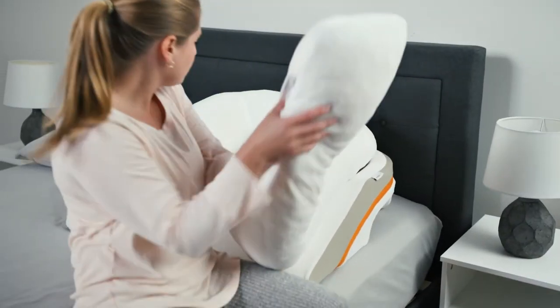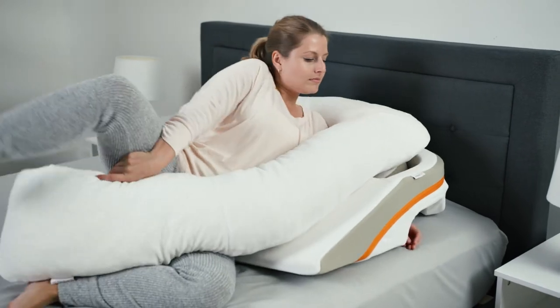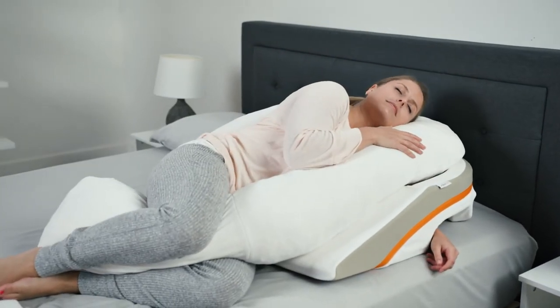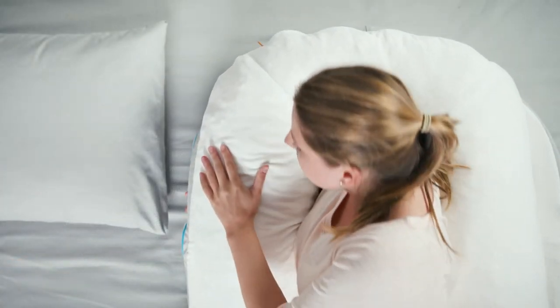Clinical studies show that for most patients, relief from acid reflux is best achieved by sleeping on your left, so you should begin each night on your left side for the best experience. But don't forget that you're free to switch sides throughout the later portion of the night.